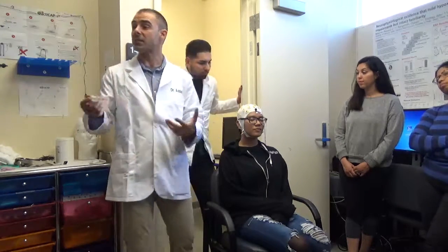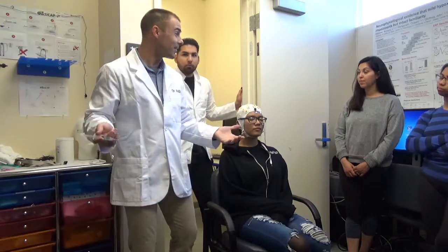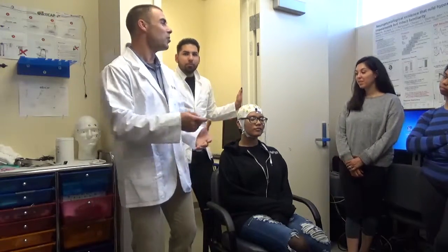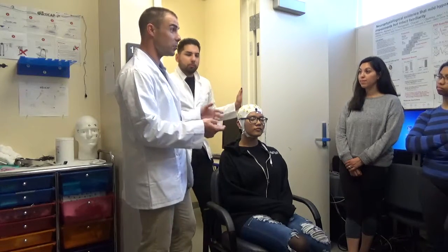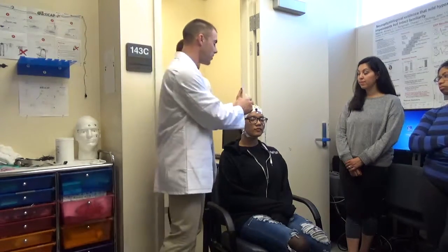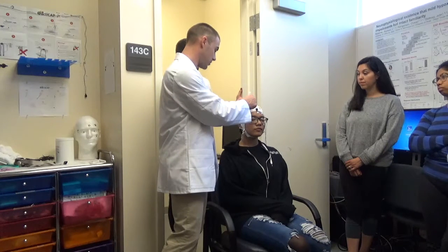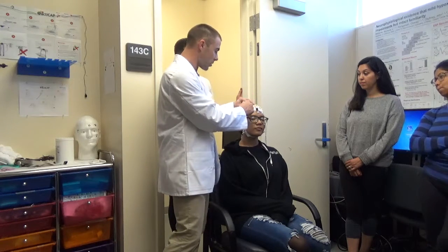And it's important to ask them for feedback, because maybe you're too gentle. Maybe you're too scared to actually make contact. Which means you're not doing anything. Right? It's not going to connect the electrodes very well. You want to ask them, can you feel that? And if they say no, you're like, okay, fine, I just know I need to go a little bit more. Can you feel it actually on the skin? Okay. Does it hurt? No. Okay, if it starts to hurt, just let me know. I'm just going to work it in a little bit.